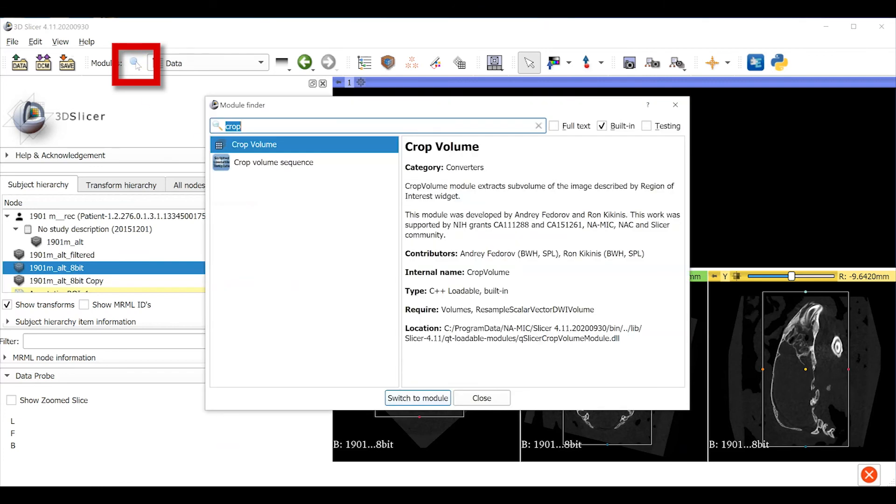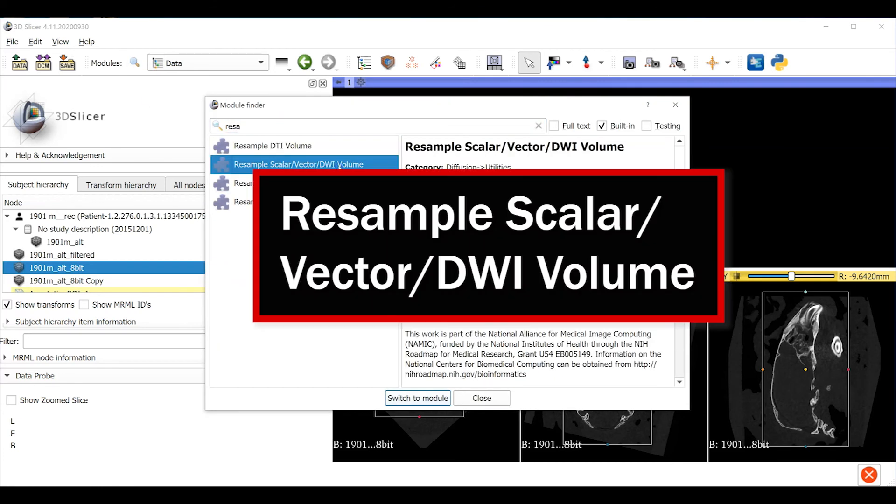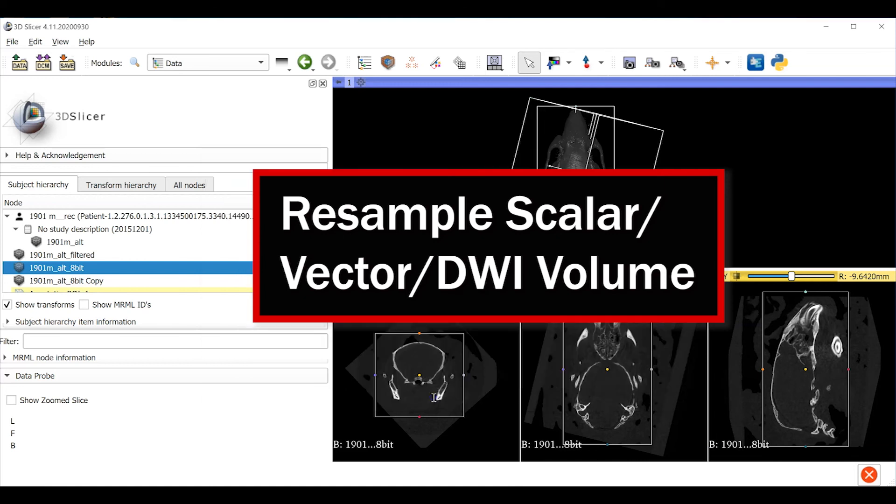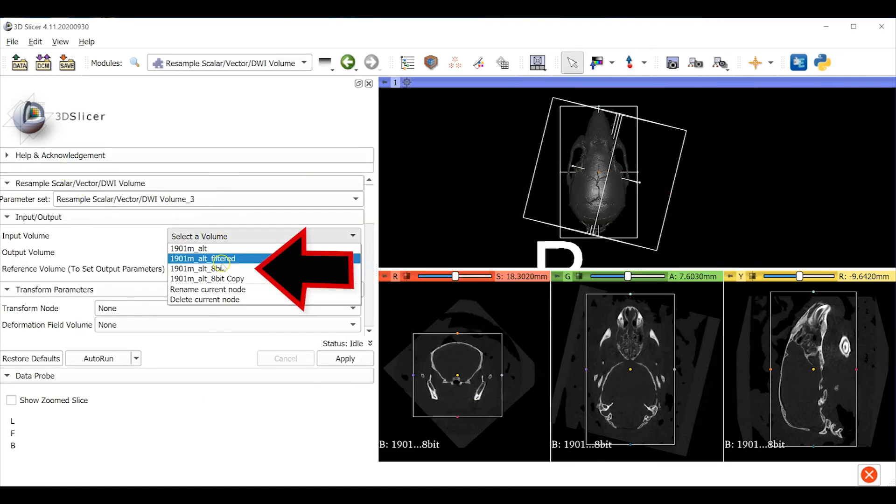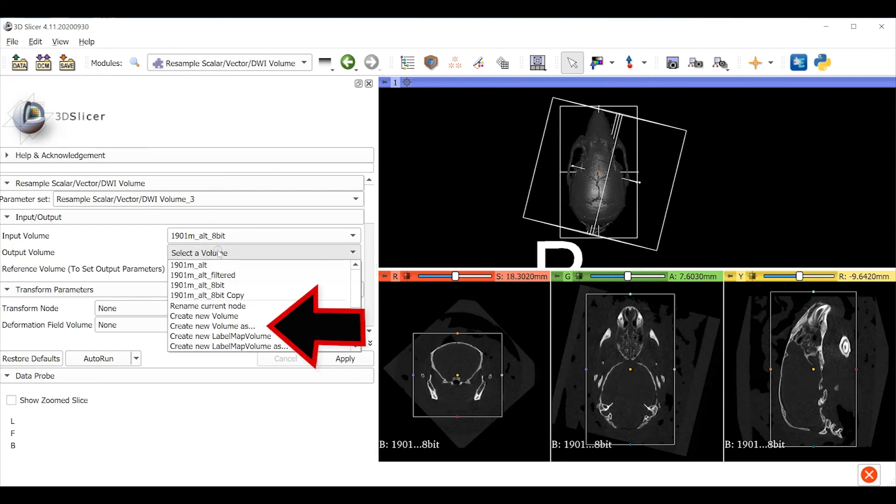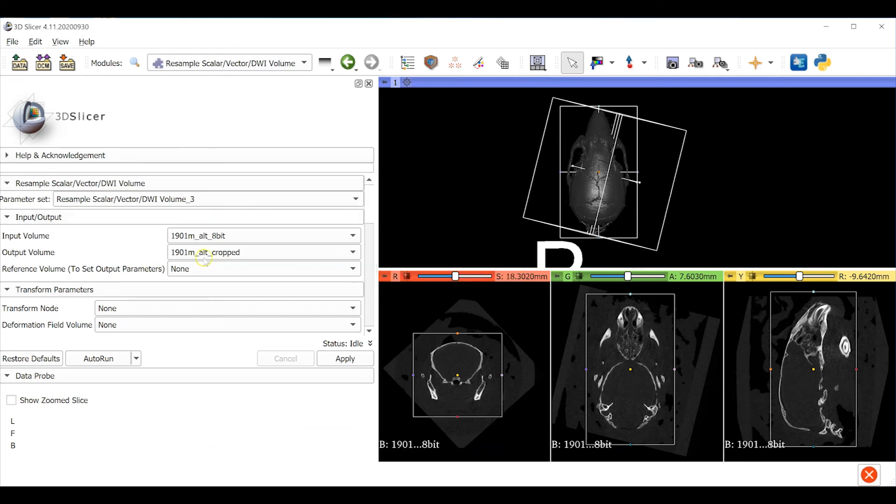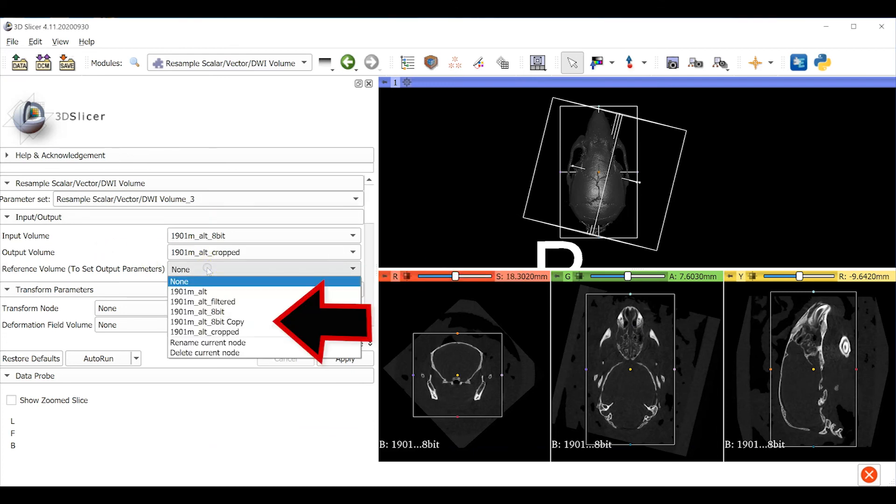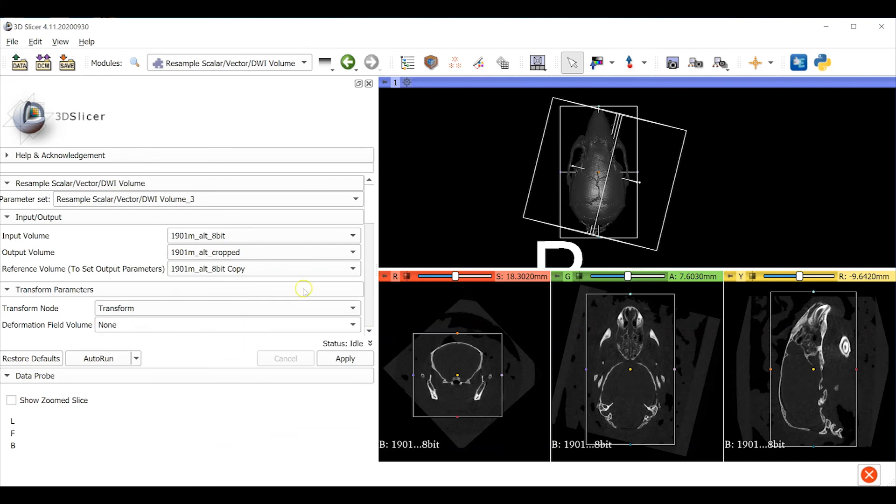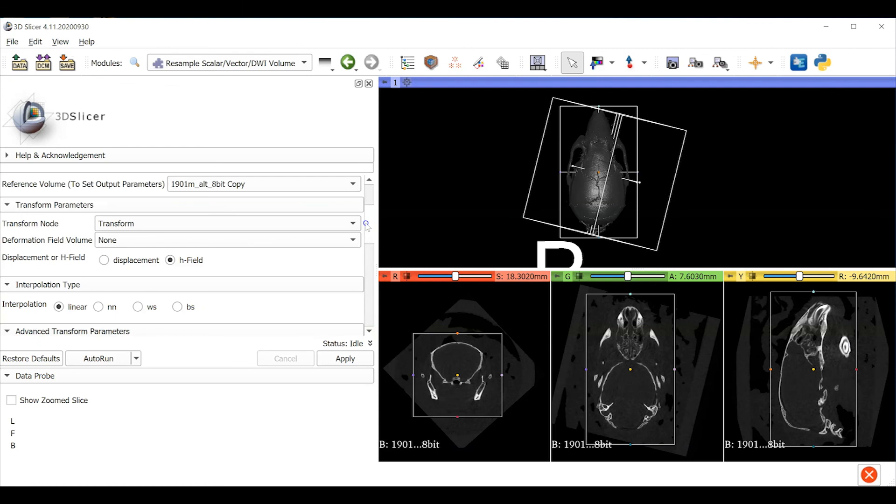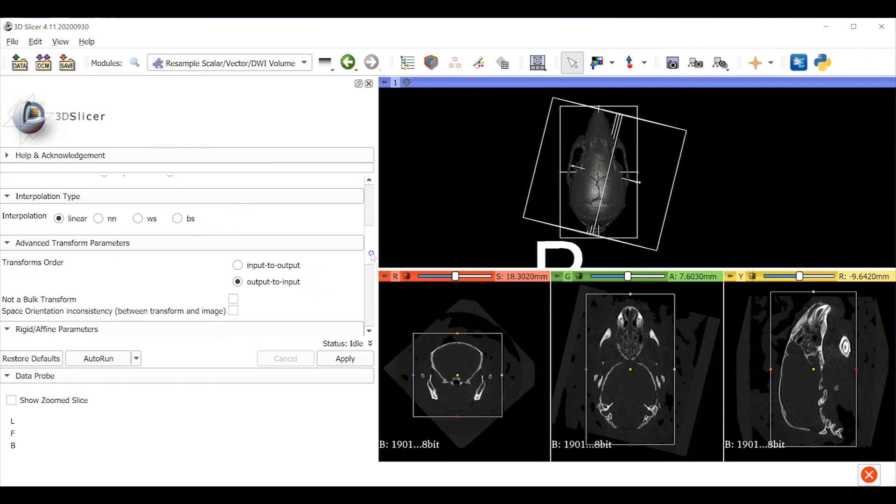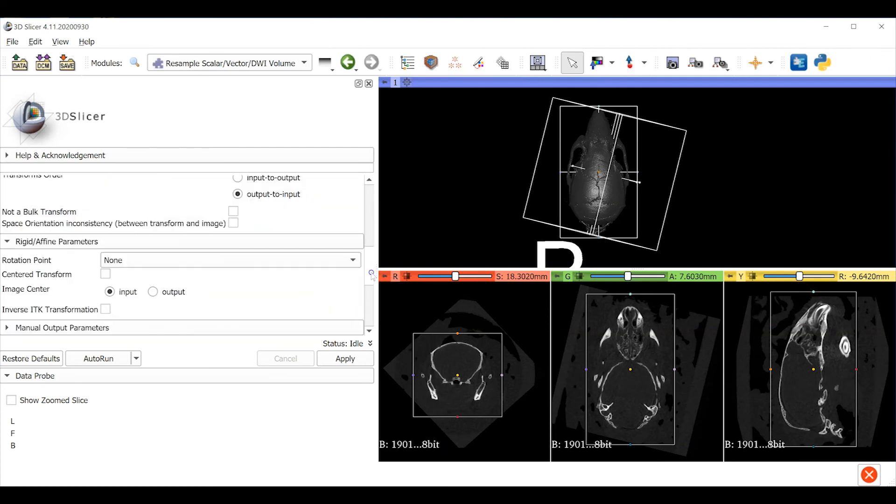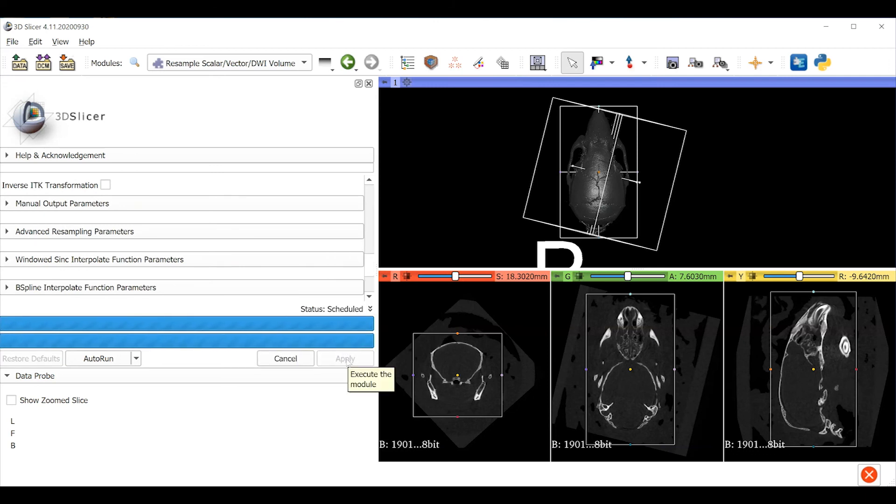Use the module finder to search for resample scalar vector DWI volume module. Set the input volume to be our 8-bit volume. For the output volume create a new volume and give it a new name. Here I'm appending the word cropped. Our reference volume is going to be the template that we just made and we have to tell the program to apply the transform. Remember we did not harden the transform earlier in this particular workflow. You can usually keep all of the additional default settings but be sure to click apply at the bottom. The resample module can take a long time to run so be patient.